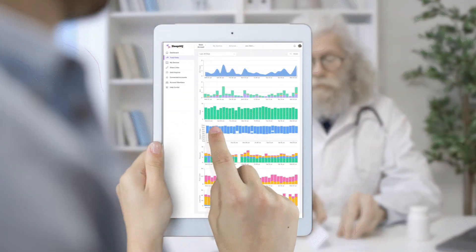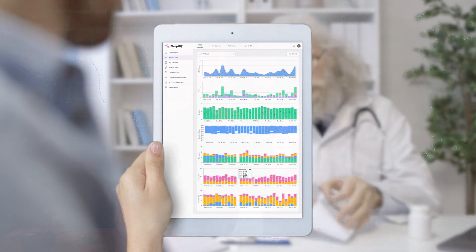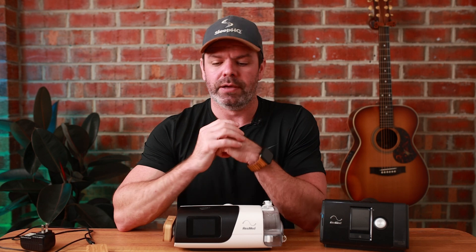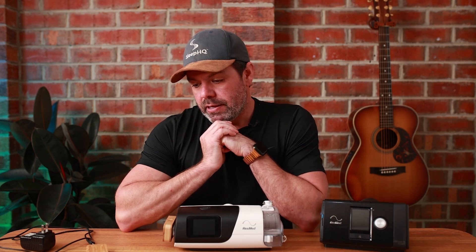analysis, and reporting your data when you need it from any device anywhere in the world. And you can share that data with anyone — the click of a button, boom, share it with anyone you like: your doctor, your mate, whoever. It's pretty damn cool.